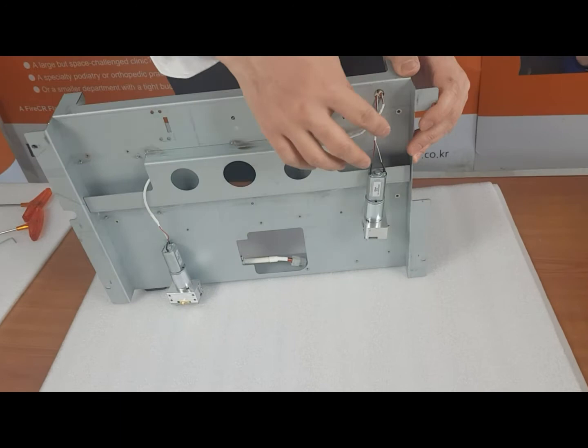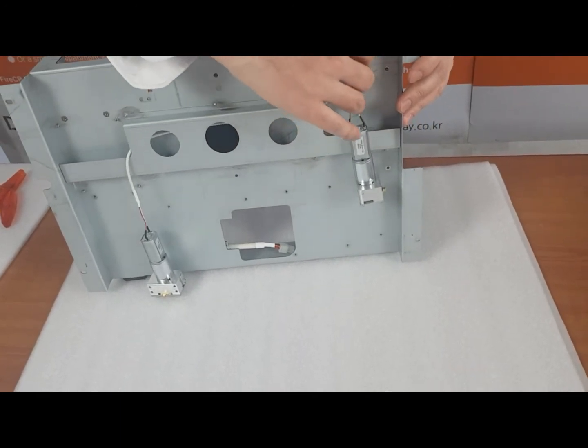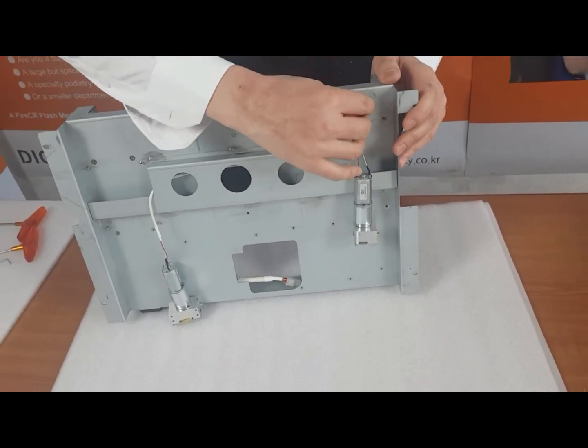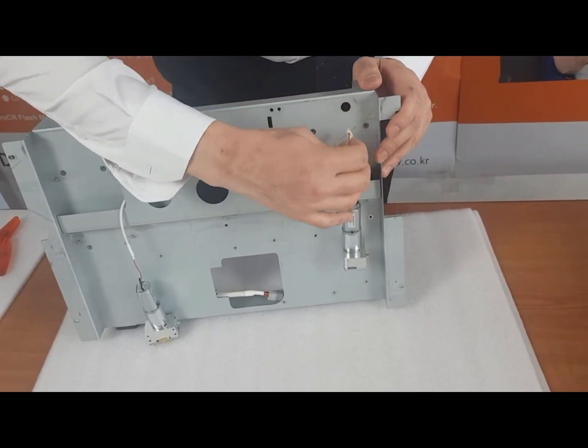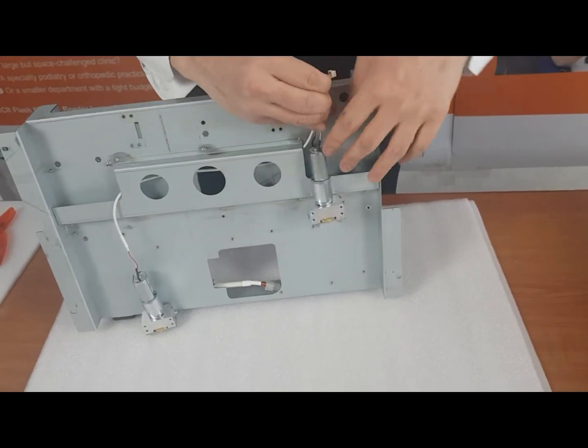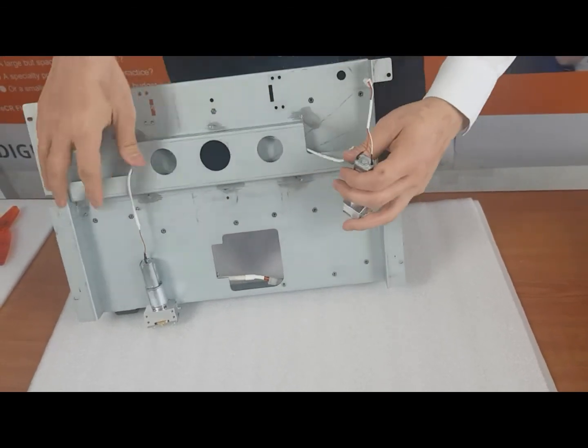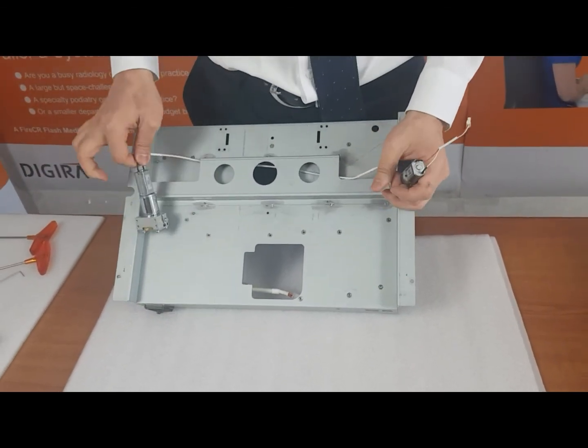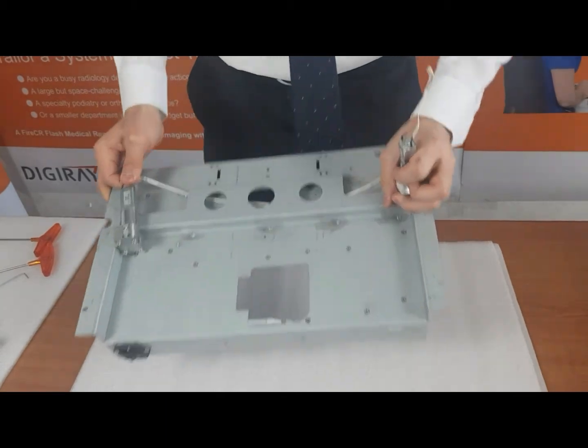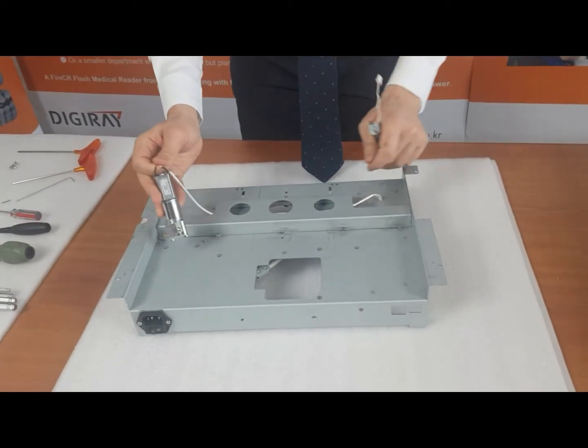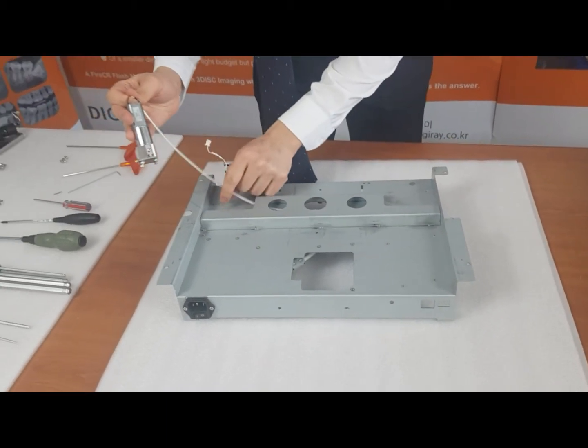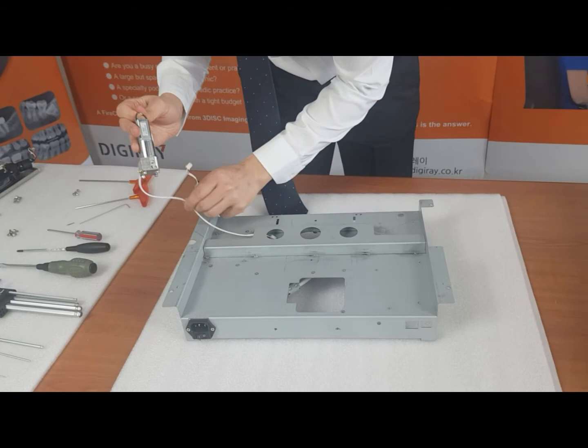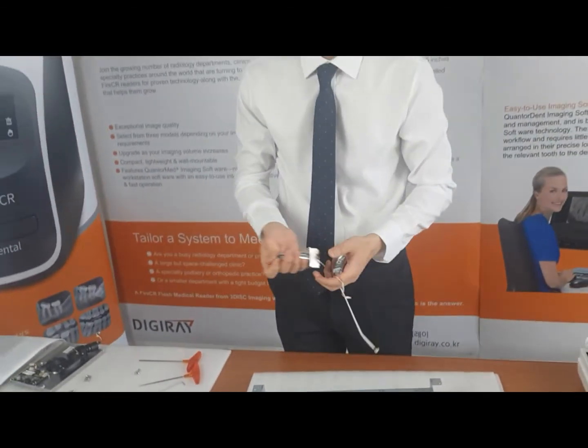So the only thing left to do now is to get this out from the block. Yeah, and that's it.